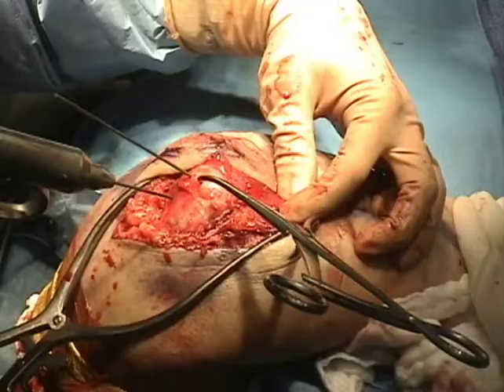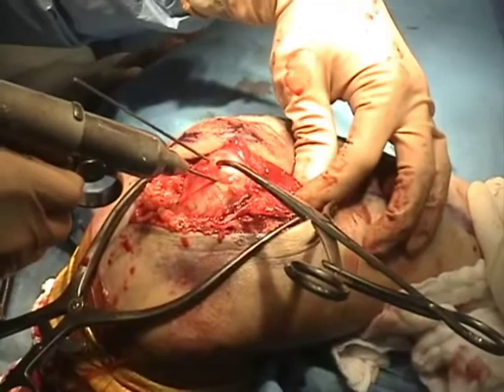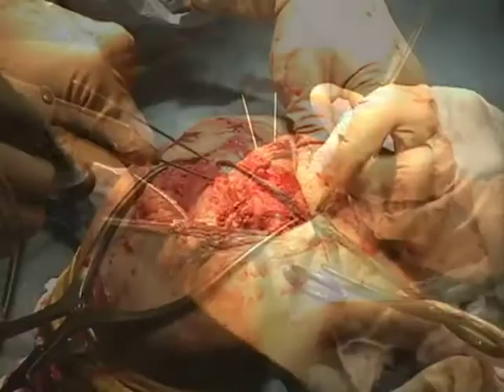It is important to recognize the valgus positioning of the ulna, which then should have the alignment of the wires parallel to that valgus alignment.